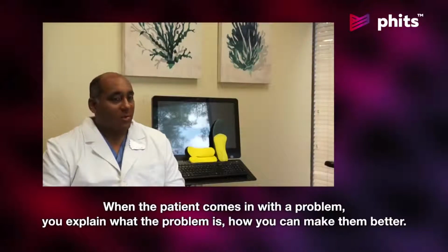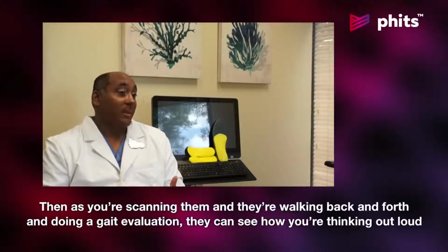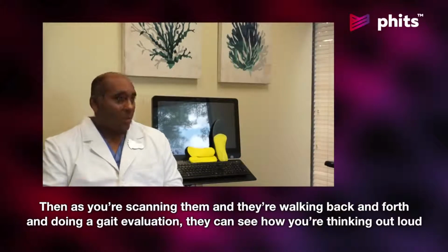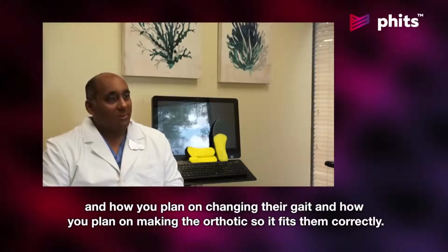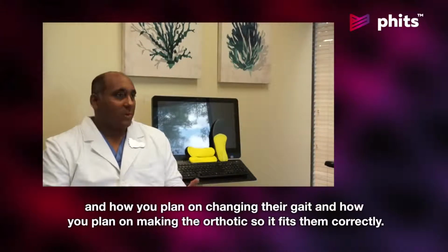When the patient comes in presenting with a problem, you explain what the problem is and how you can make them better. Then as you're scanning them and they're walking back and forth doing a gait evaluation, they can see how you're thinking out loud, how you plan on changing their gait, and how you plan on making the orthotic so it fits them correctly.